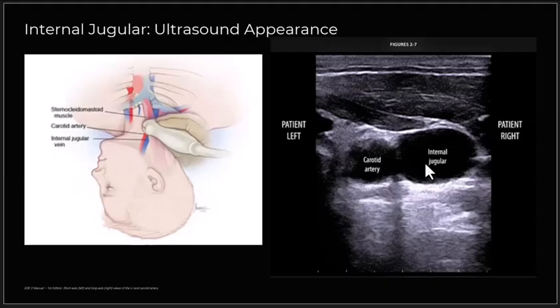For example, if I'm at the bedside and I'm scanning the patient's aorta in the short axis, the indicator is kept to my left. If I'm doing a DVT exam over the femoral vein, the indicator is kept to my left. If I am scanning the IJ vein, I'm at the head of the bed looking towards the patient's feet, I keep the indicator to my physician's left.